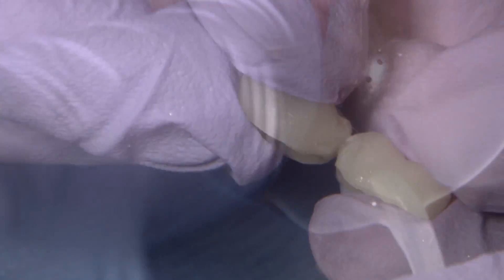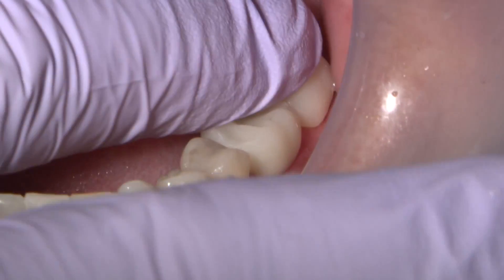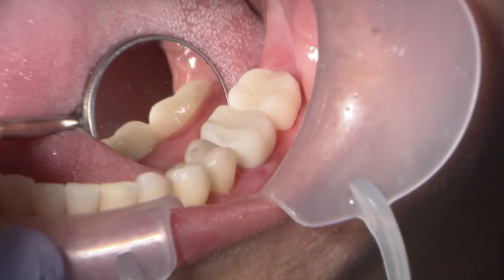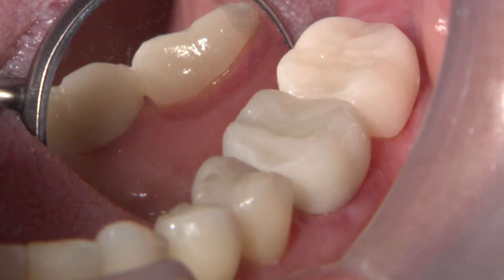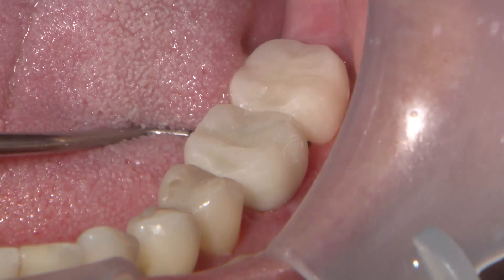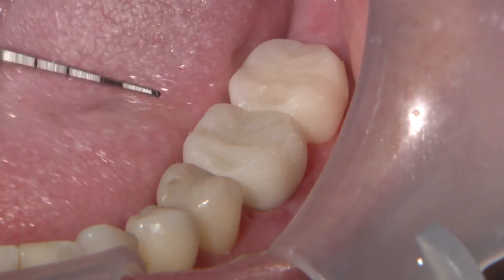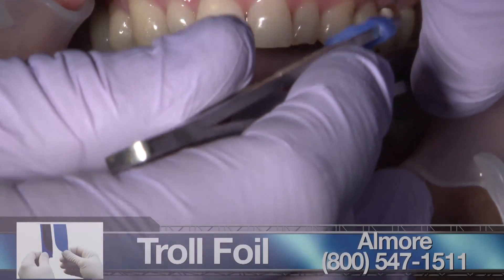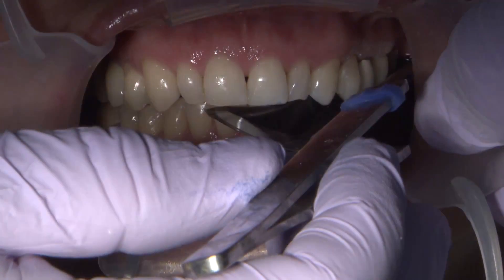This is really going to come into play when we take these off eventually — the patient's tissue won't be irritated or bleeding when we're trying to cement in our permanent restorations. On the lingual, the only space I can see between the gingiva and the preparation is where my retraction cord from the final impression was placed. Other than that, my margins look good. I always make sure I can fit an instrument through those embrasures — if I can, the patient can fit floss and remove any contaminants. I make sure my contacts are good with the natural teeth, checking occlusion and adjusting if necessary.